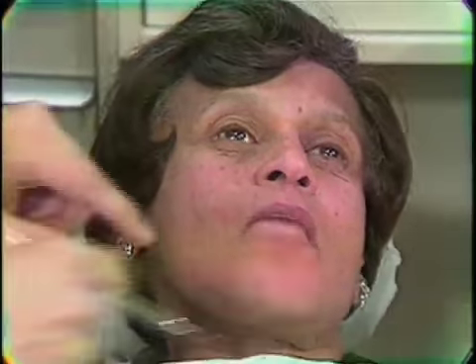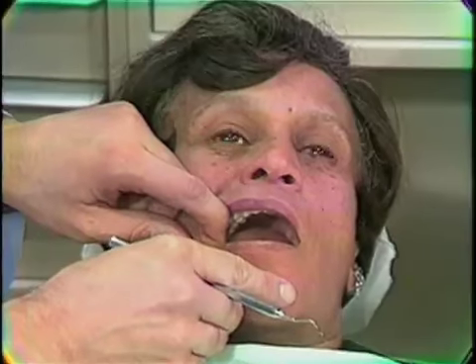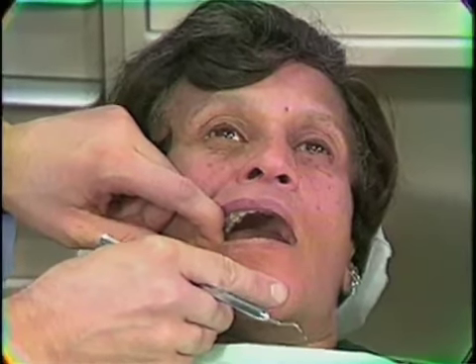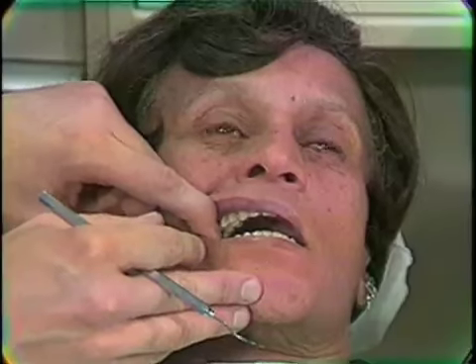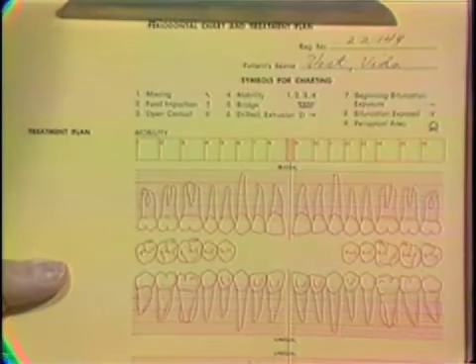Now, let me demonstrate the charting of this quadrant on the patient. We'll try to split the screen here so that you can see me charting at the same time that you can see the data recorded on the chart. I think that when you're using an assistant, it would be well for her to call out the areas that you would like to chart, and then you can give her the pertinent data. All right, now let's begin the charting.